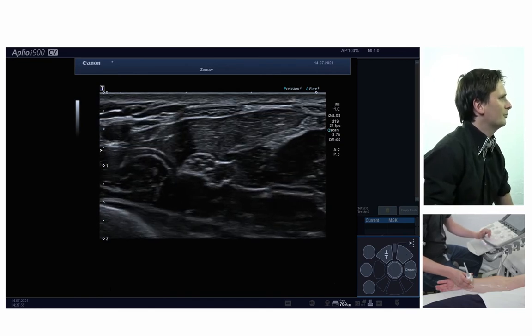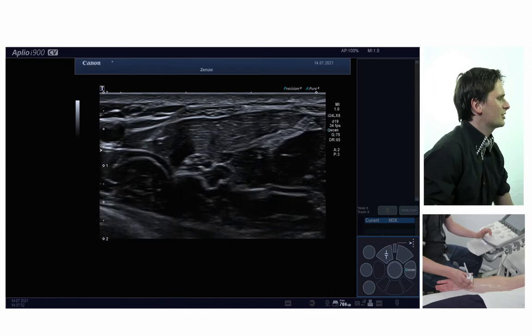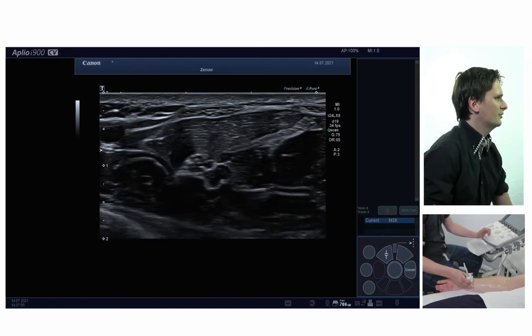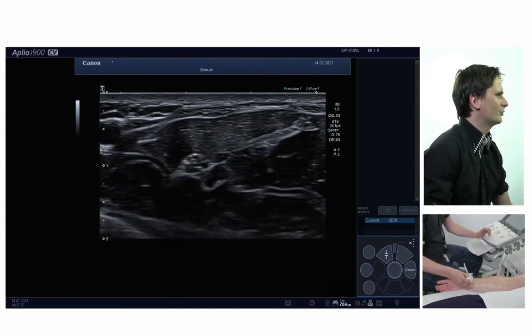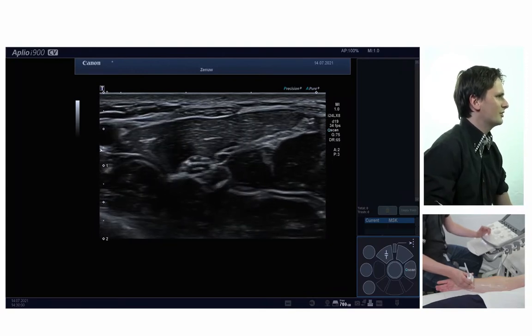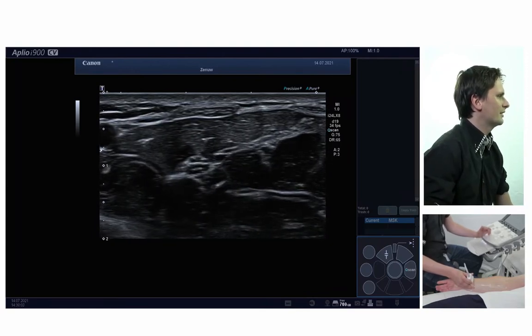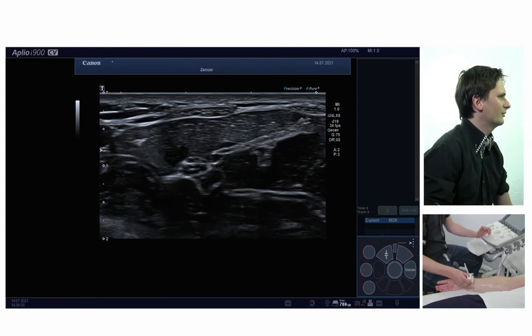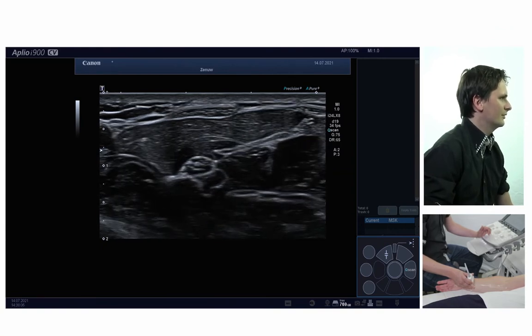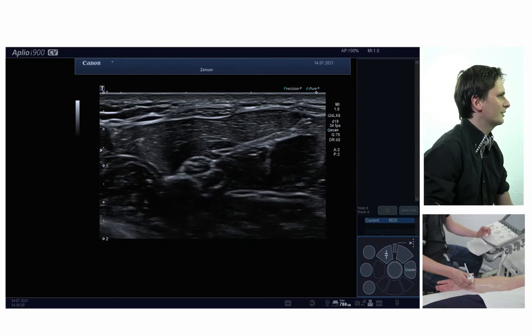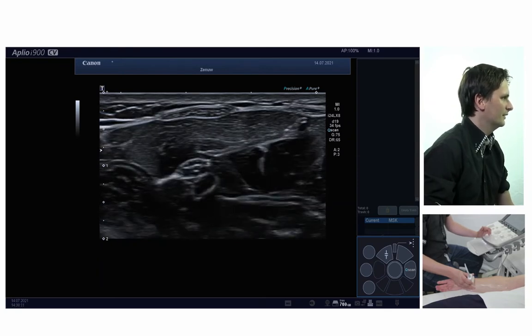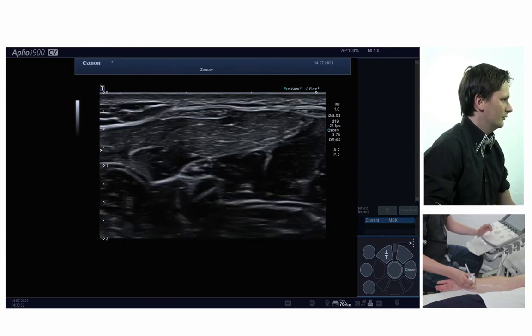If you should see a profound enlargement of the nerve on this side, you should try to image the nerve more proximally as well, because there may be nerve disease other than carpal tunnel syndrome causing the nerve enlargement — for instance, a hereditary polyneuropathy or CIDP. So I'll follow the nerve more proximately.